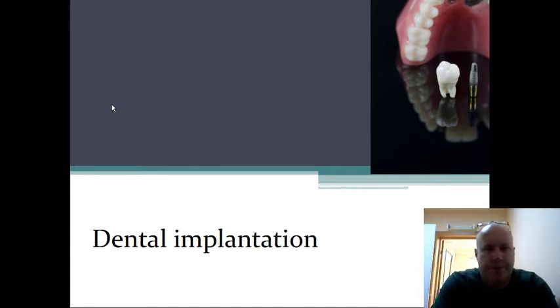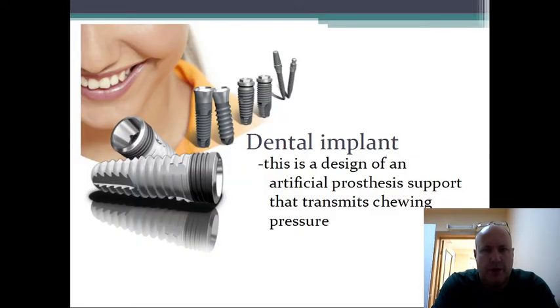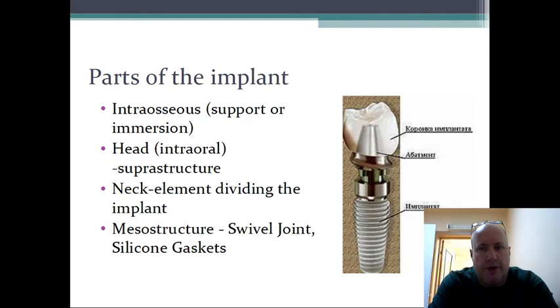Good day. Now we'll speak about dental implantation. Here you can see on this picture a dental implant. This is the design of an artificial root support that transmits chewing pressure. Here you can see parts of the implant.